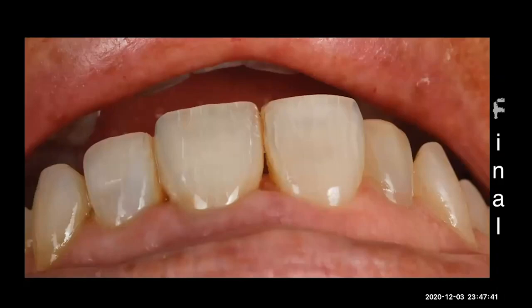The right ingot. Not because it's an anterior case does everybody use HT, because everybody assumes that HT means translucency and it's aesthetic. No. For me, it's the opposite. HT is a block that I use only for onlays because they need to absorb the concavity of the tooth. I use different materials to do my aesthetic cases. I never use HT to make my anterior cases. I use LT, I use MT, I use multi.